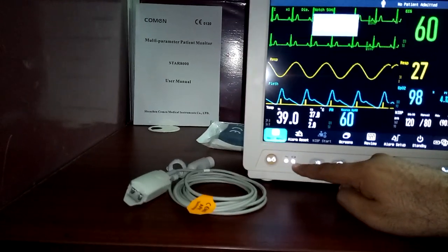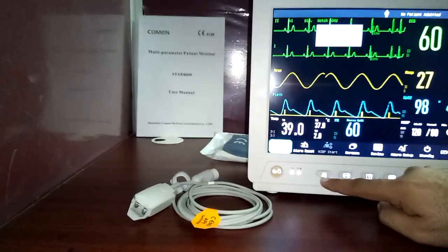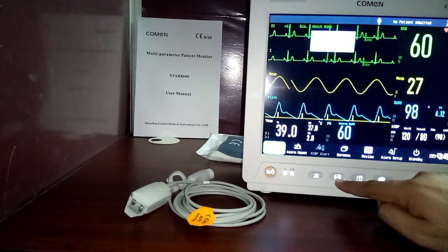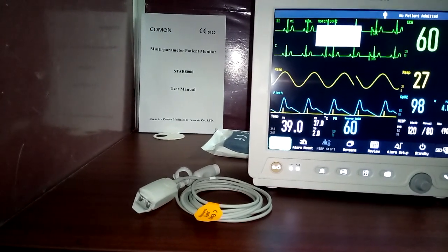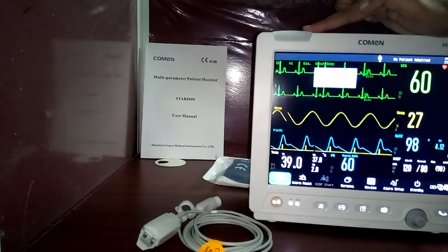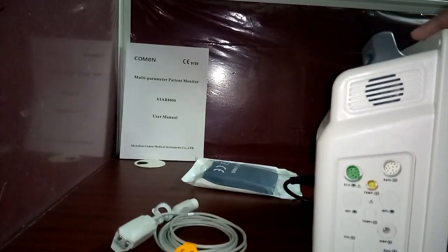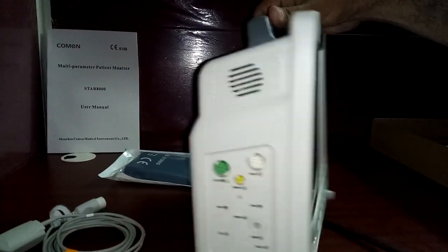These are the mains and battery charging indicators. There is a backlight in the buttons, so you can use the monitor in a dark environment without disturbing the patient at night. This is the multi-angle alarm indicator — the alarm light can be seen from all angles, including from the back side.